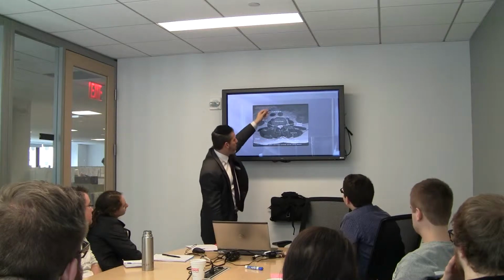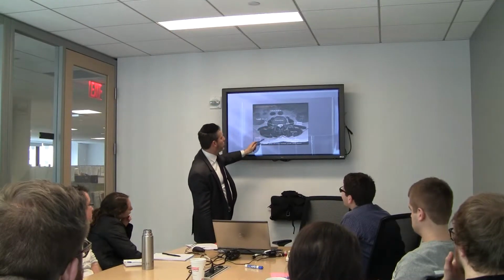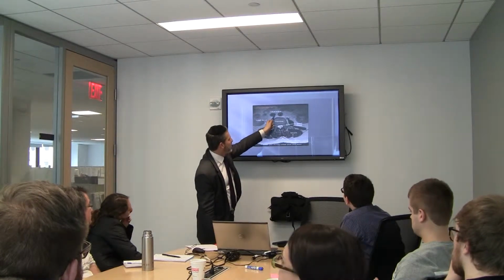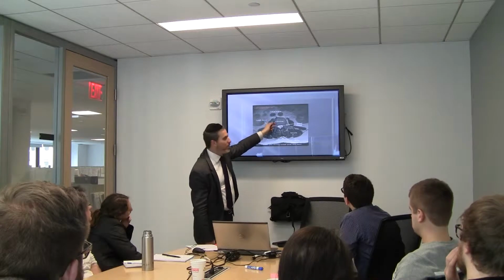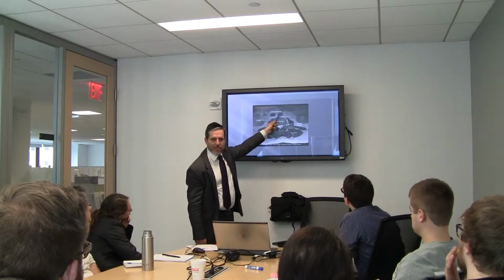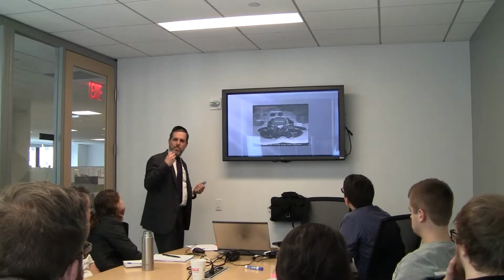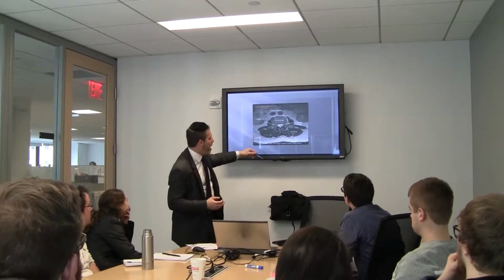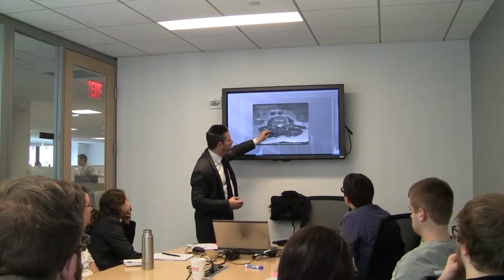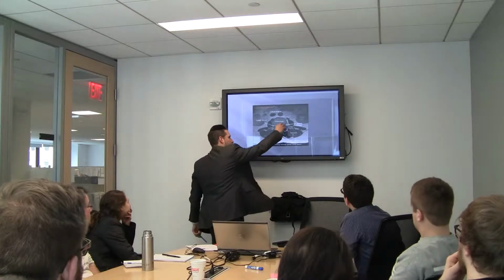Here again, this is the front, this is the back, this is the fat, these are the little nerve rootlets. You're seeing the abdomen, these are the vessels, the right-sided vessel, probably the vena cava and the aorta towards the left. Those magnetic waves transmitted onto a particular signal give phenomenal detail. Here you have the posterior spinal muscles. Again, this is anterior, this is posterior. We're looking down.